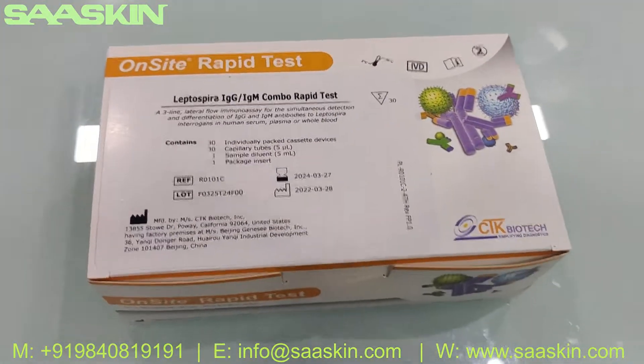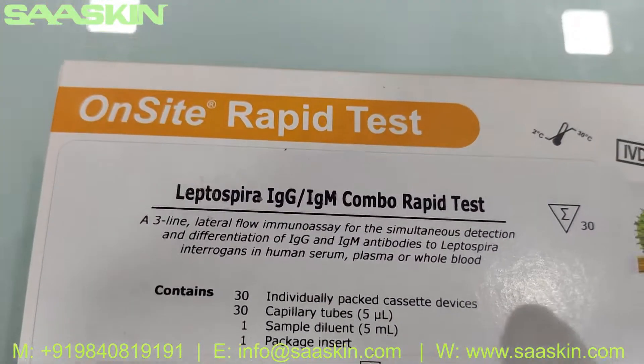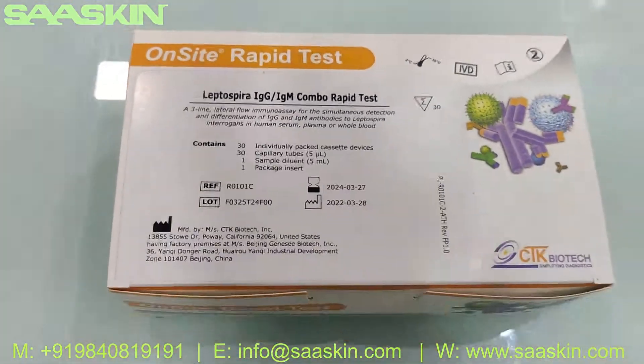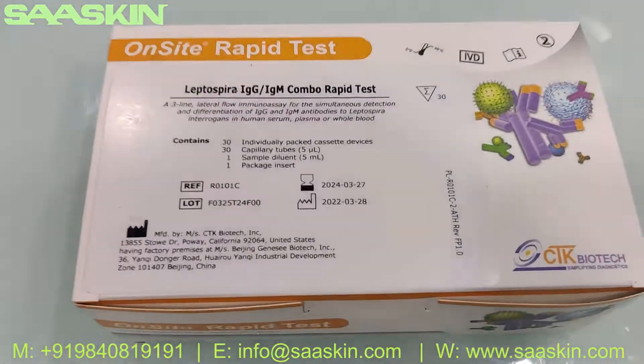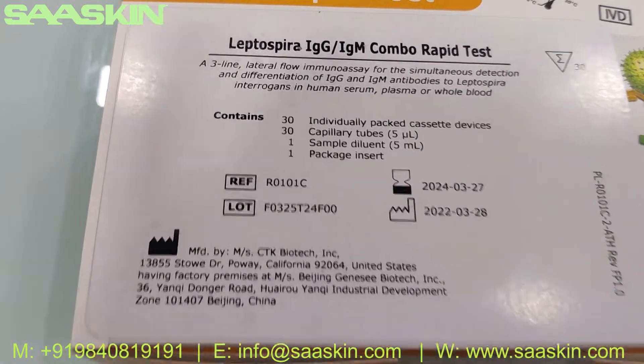Hello everybody, today we are going to see the unboxing of CTK Biotech from the US — the OnSite Leptospira IgG IgM Combo Rabbit Test Kit. This is how the box looks like. This is a completely IBD certified product.